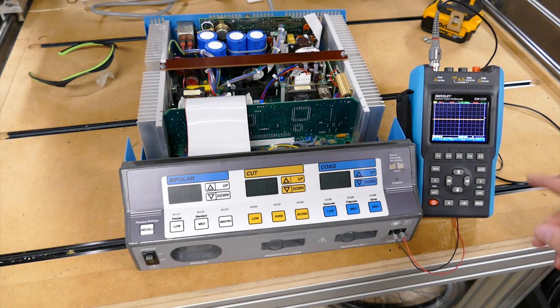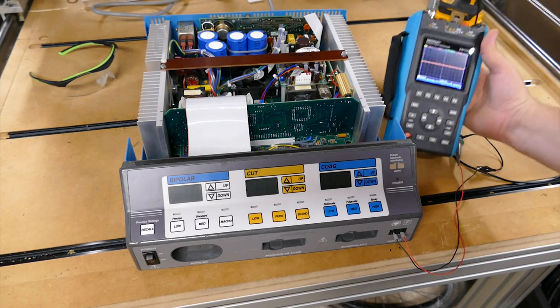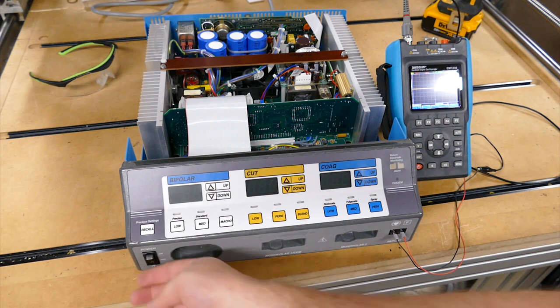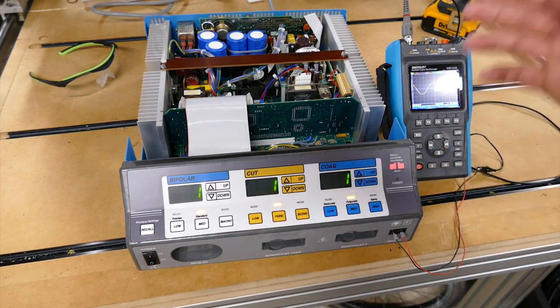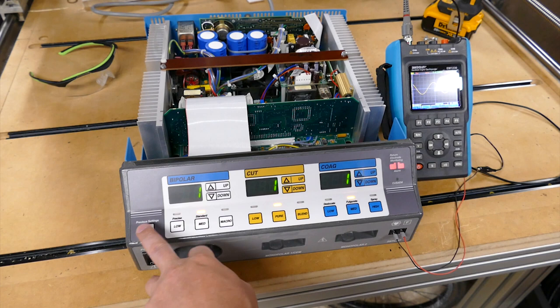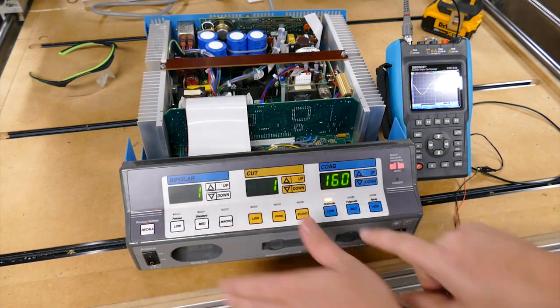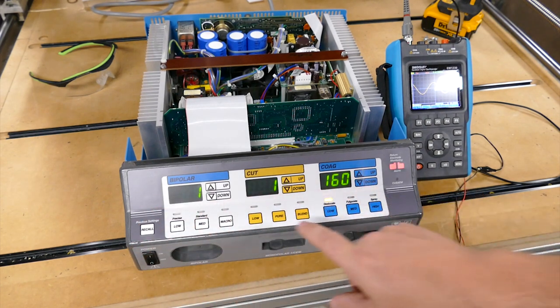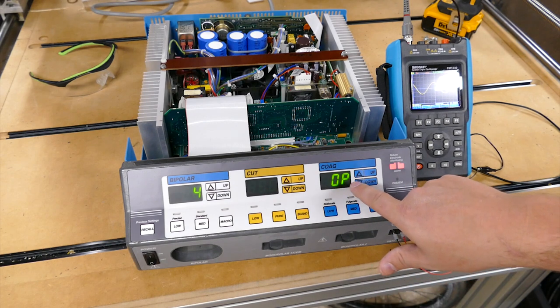The first thing we need to do is hook up the oscilloscope to the patient return electrode connector. You can see I've just got it coiled around and connected over to my probe. Next thing we need to do is turn on the unit. You can see the oscilloscope is finding a signal. All right, now the unit says 111. It's ready to be put into calibration mode. In order to do that, you're gonna hold down recall, pure, and desiccate, which is low. There you can see it says 11160. This is your programming mode. We're going to put it up on number 4, and you should see OP over in the coag.